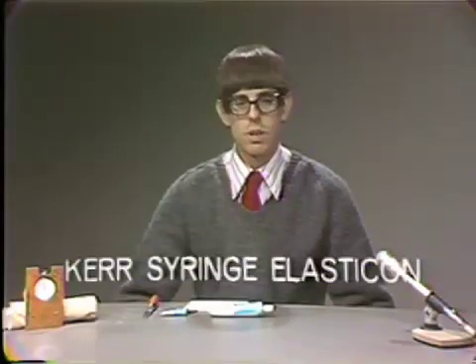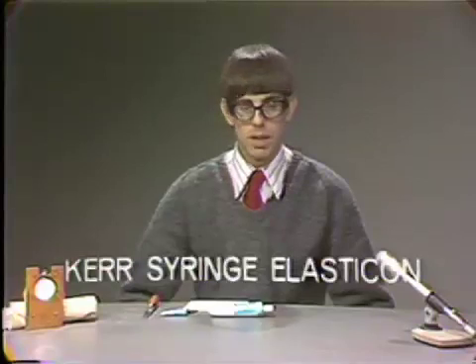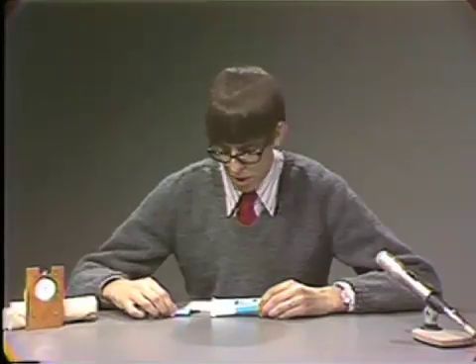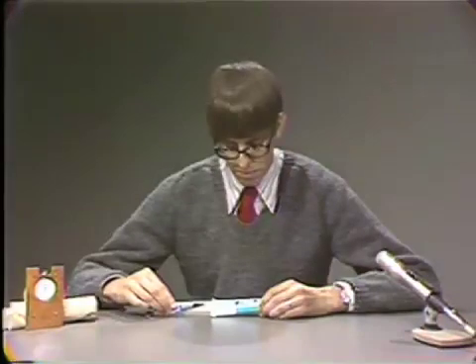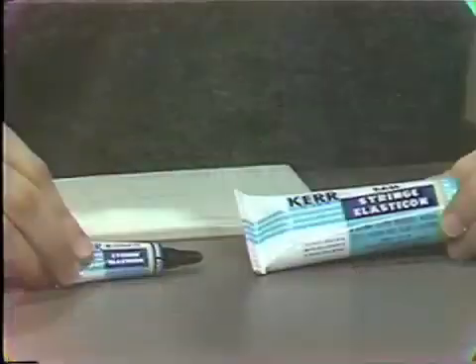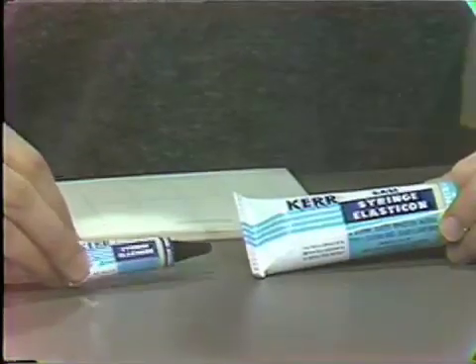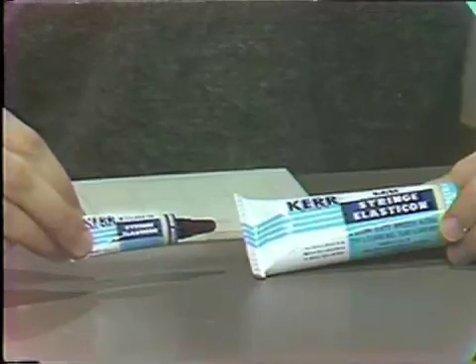The first material is Syringe Elasticon, made by the Kerr Company. Syringe Elasticon comes as a paste and a liquid system, with the base in the form of a paste, and the accelerator in the form of a liquid.